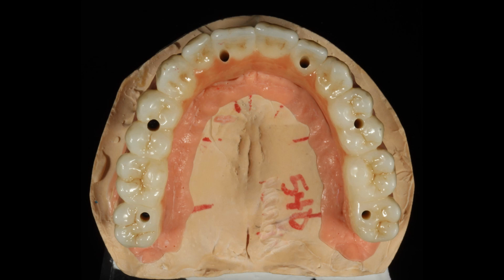I also want you to notice that the patient elected to go with some slight imperfections in his final restoration. Again, he wanted these to look natural, and that's one of the, not just the color and character, but we can also change the way light refracts off of the teeth by introducing ever so slight crowding, and that's what you see here.